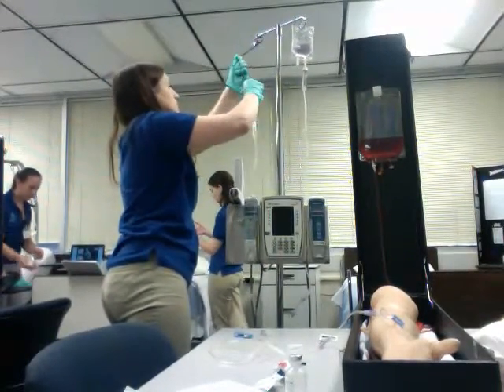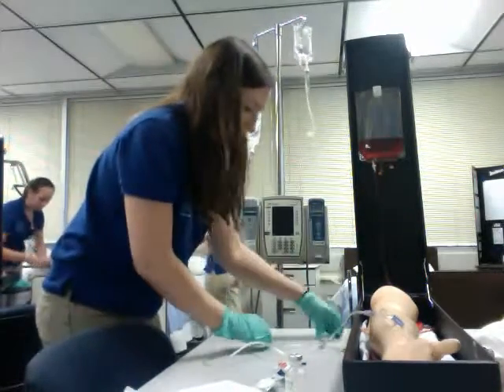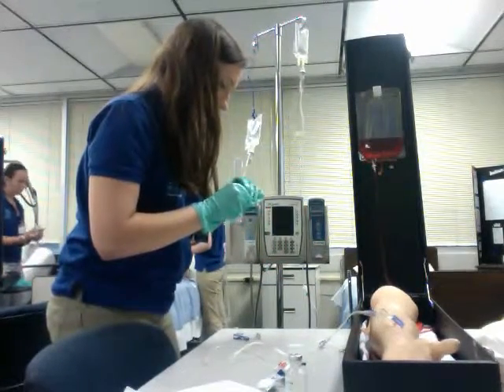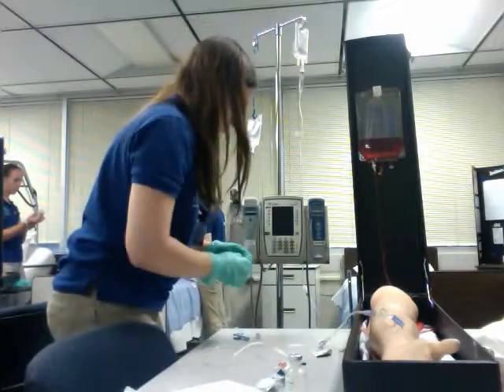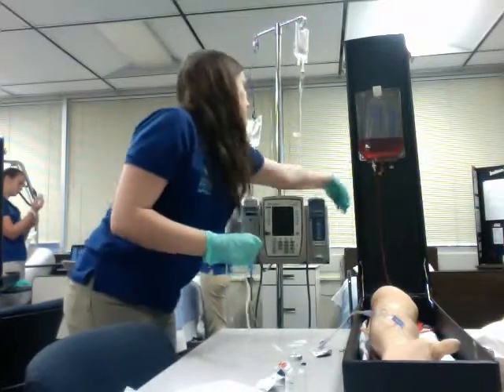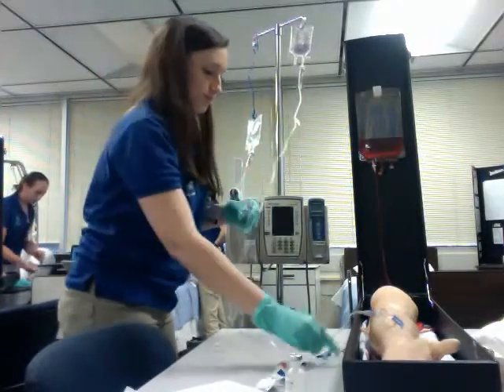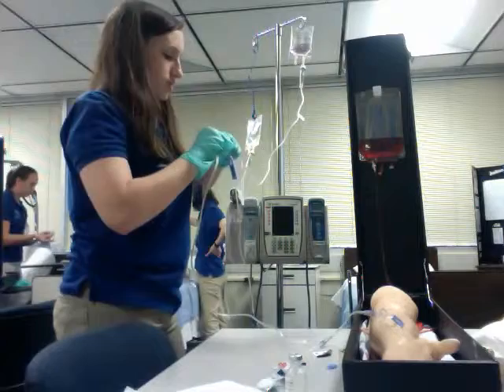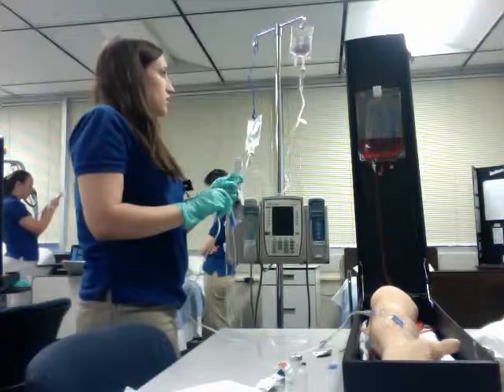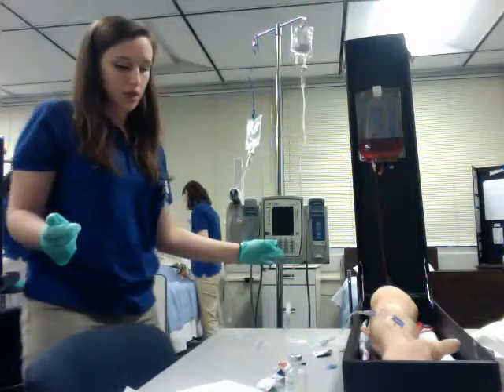So I'm going to draw out my 6 milliliters. And then I'm going to clean the port with another alcohol swab. Put 6 milliliters in the bottle, so I can take 6 out. I've got the primary line clamped off, so that's all set. I'm going to remove this and attach it to this. And now I'm going to unclamp the piggyback line and establish the flow rate, which is 17 drops a minute. So I've finished with that.